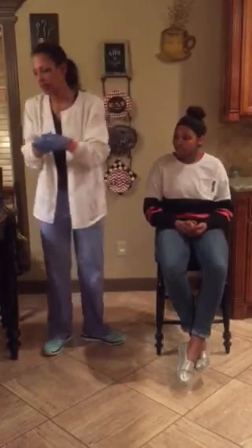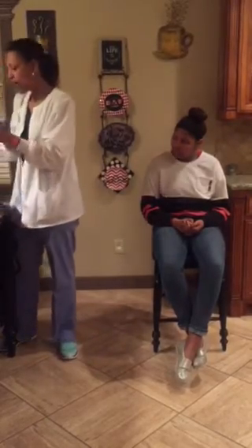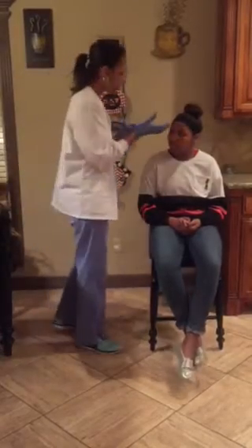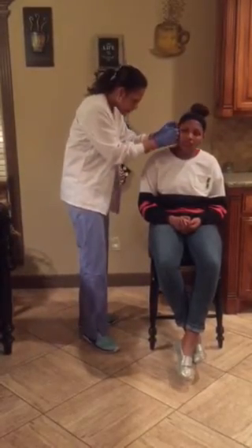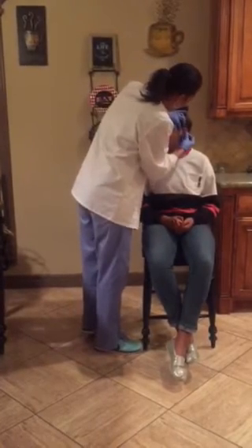So now we're going to move on to your ear exam. I'm going to change my gloves out here because I want to look in your ears. So I've changed my gloves out. Again, with my otoscope, I just kind of want to look at your ears. I want to look at them first. Have you had any problem, difficulty hearing or anything like that? No. Okay.